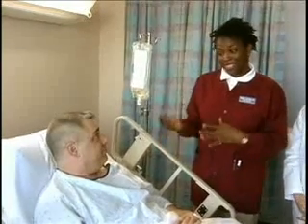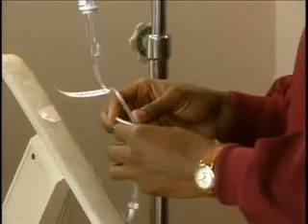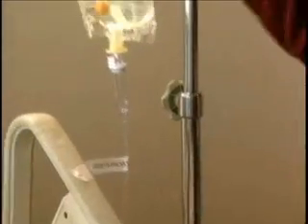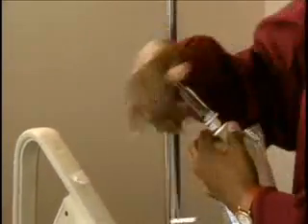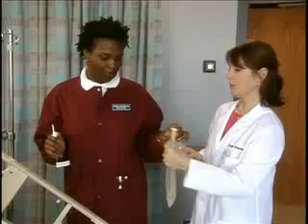Okay, so now I'm just going to change the solution. First, I close the clamp on the administration set tubing. Take the container that was hanging from the IV stand and invert it. Good. Now remove the spike from the old bag. Be careful not to touch it. Okay. There you go.